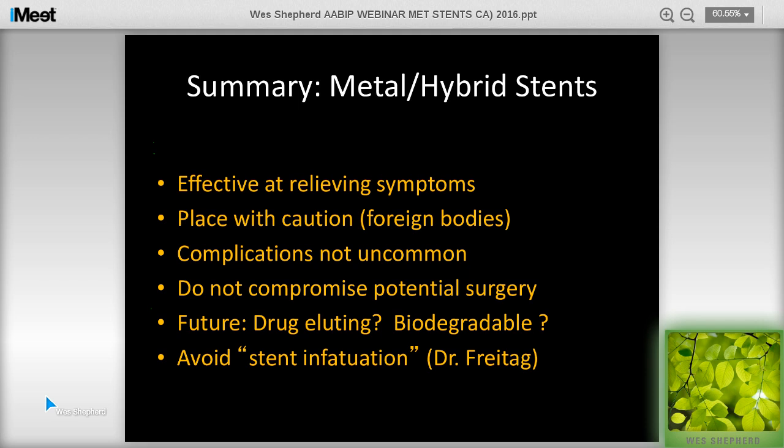If a stent fracture leads to compromised lumen, again, then it would be reasonable to take it out if the stent's not too embedded and it's not going to put the patient at significant risk. But if the fracture does not cause significant compromise in the integrity and function of the stent, it's probably not unreasonable to leave it in place.